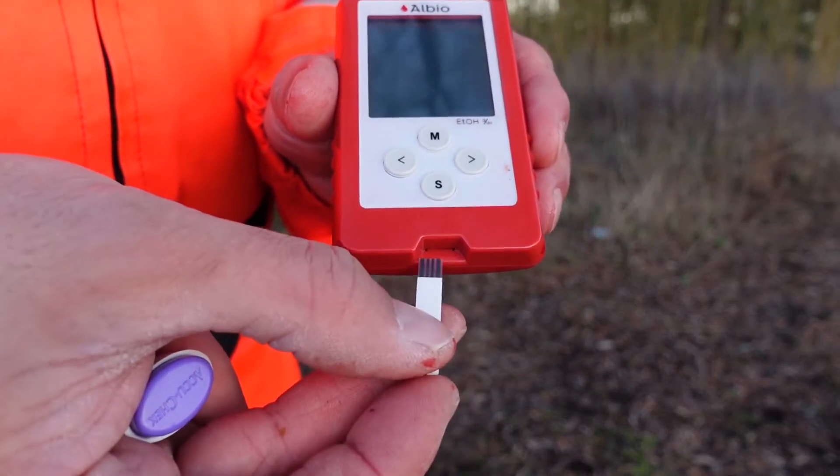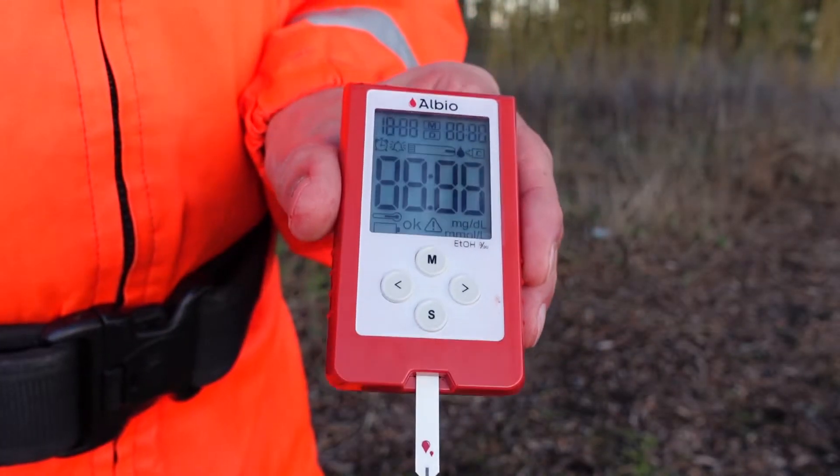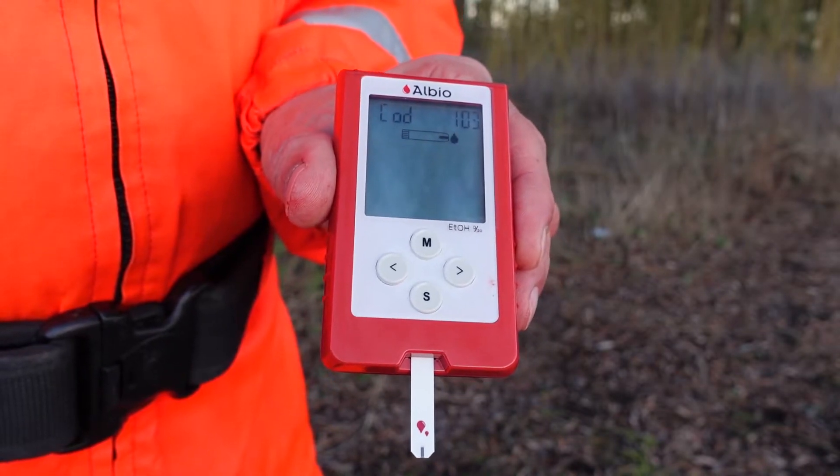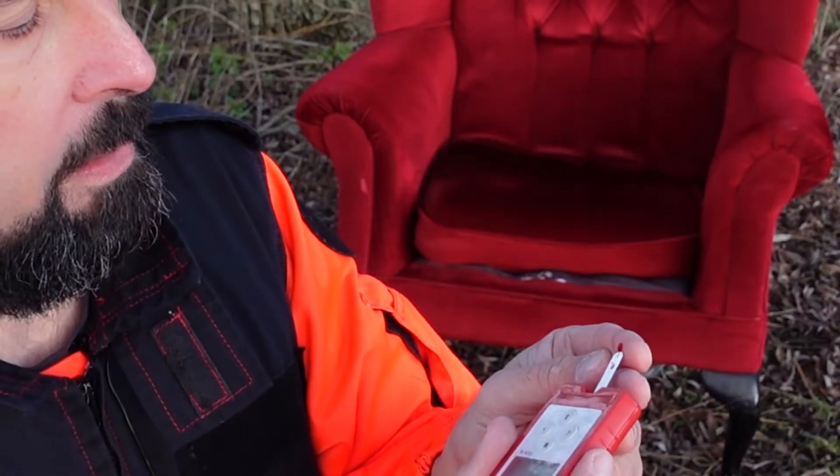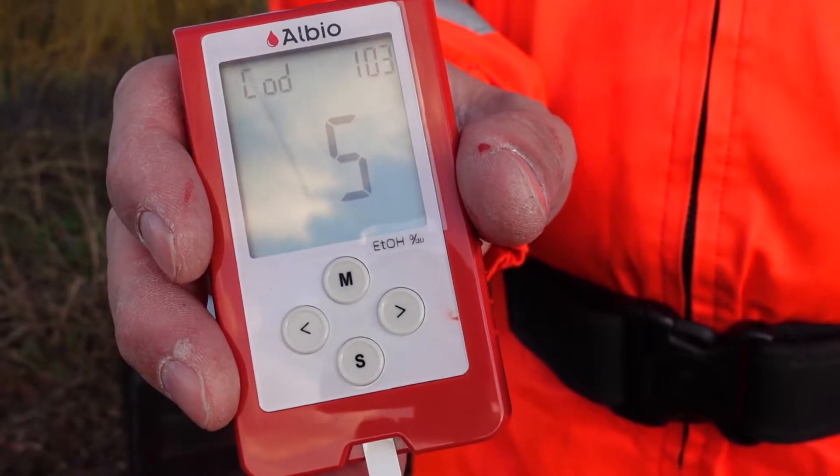The device itself looks like a glucometer — or a BM kit as my British colleagues would say — and you use it in the same way. You pierce the skin, wipe the first two drops of blood away, and take a sample from the third drop of blood.